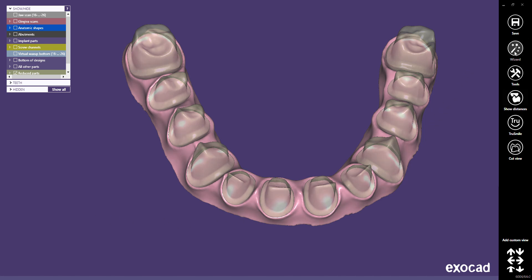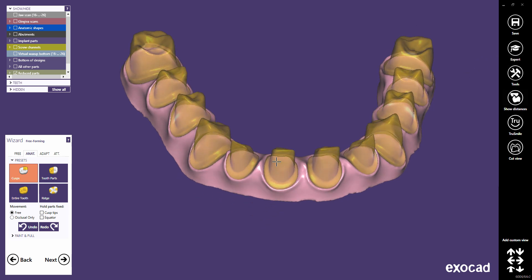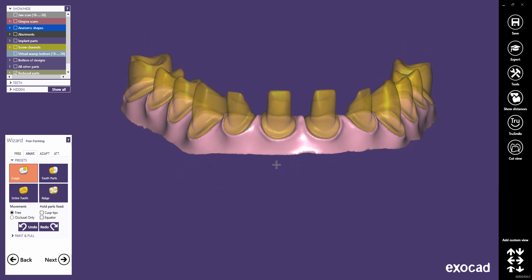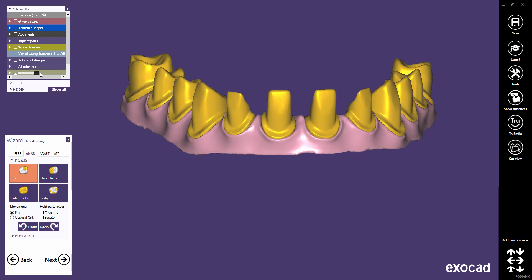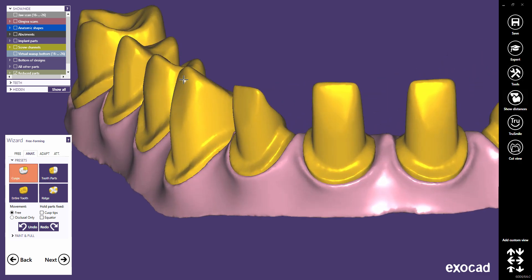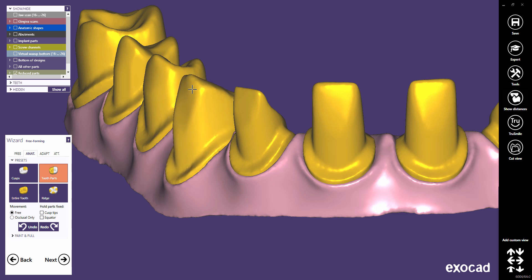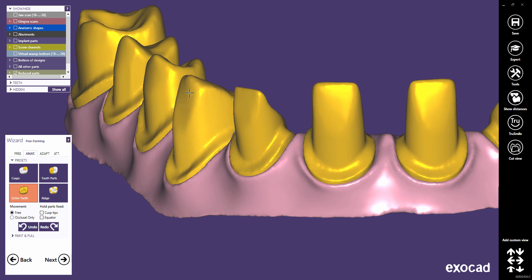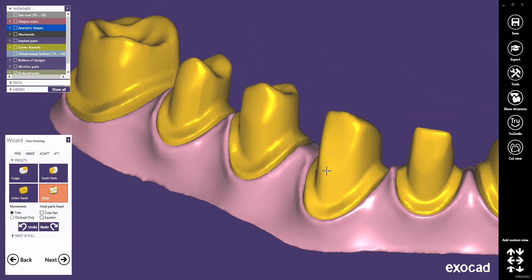Now we can continue in the wizard and restart at the stage where we left it. Here it is even possible to freeform the thimble crowns. The Cusps allow you to modify the upper parts. Tooth parts move bigger areas. Entire tooth moves the whole thimble crown. And Ridge just the top ridges of the thimble crown.